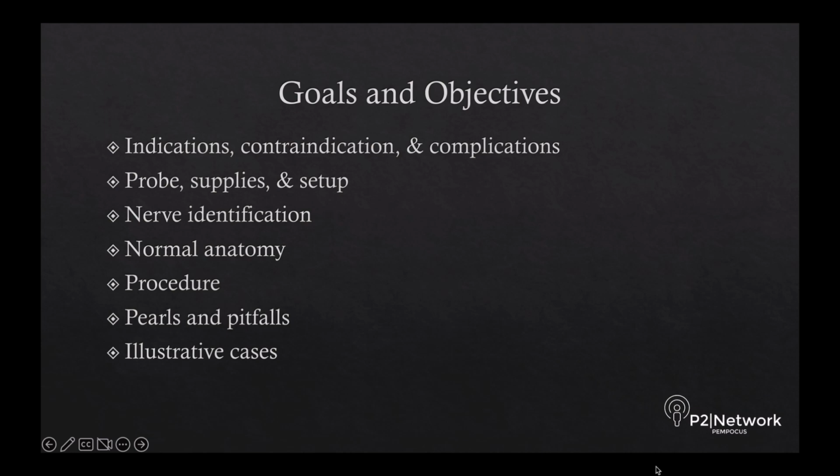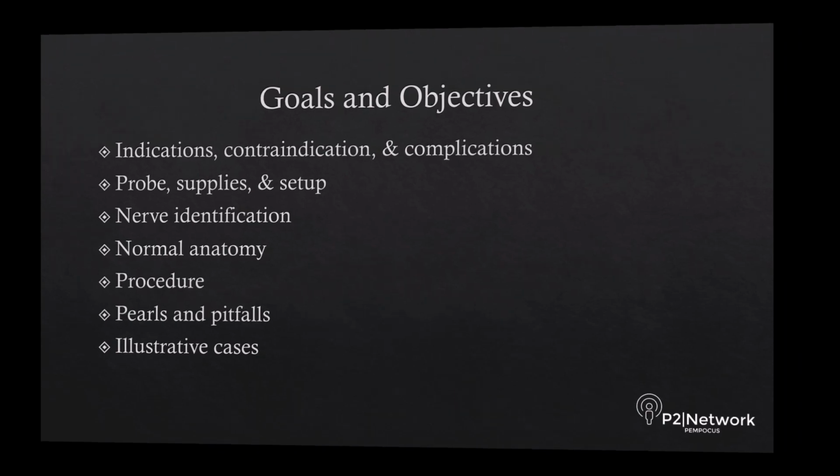Our goals and objectives for today's lecture are to review the indications, contraindications, and complications when performing blocks, discuss the probe, supplies, and setups needed, talk about nerve identification and normal anatomy, review the procedure, discuss pearls and pitfalls, and review a few illustrative cases.